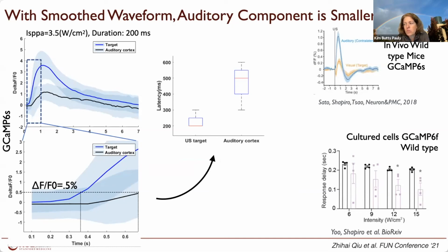So there's two parts. One part is that underneath the focus it's a more direct measurement. But you do raise an interesting question, and I'd have to go back to the setup. I'm not sure I have a picture of the two different setups, but ours is different in that the ultrasound is coming in straight, normal to the surface of the brain. What they had done is that in order to get their optics to work, they didn't have that ring transducer. Instead, they had the ultrasound coming in from an angle, and their optics were straight on.